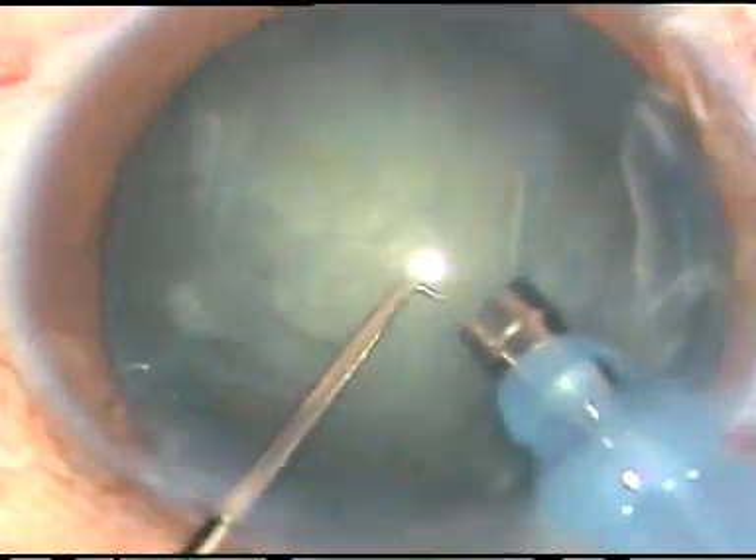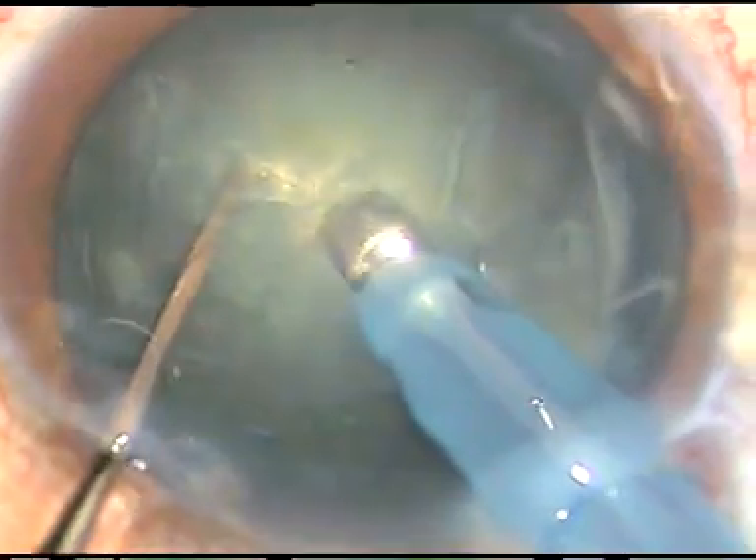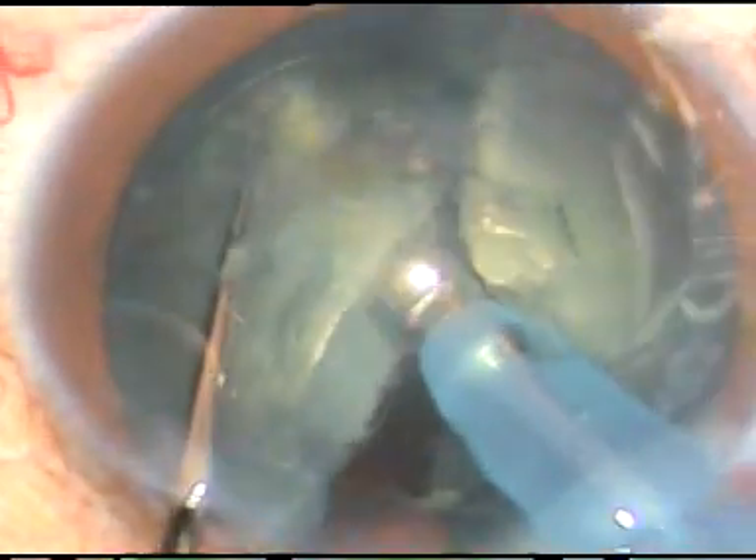Now this is the second case — a little harder nucleus. The tip is embedded into the substance of the nucleus. And this is direct chop, direct vertical chop.